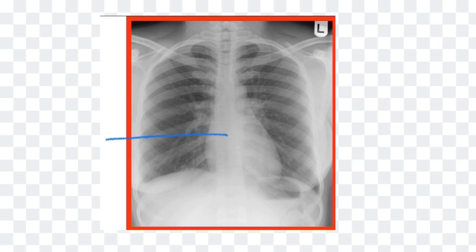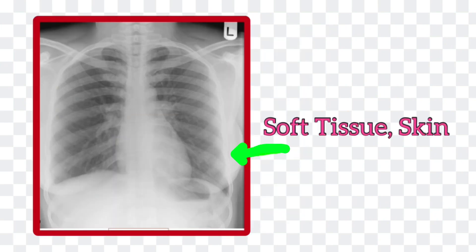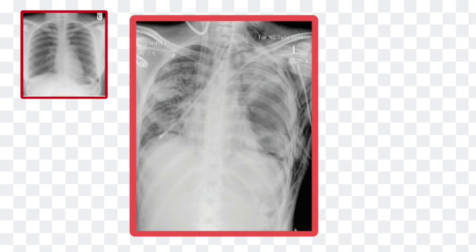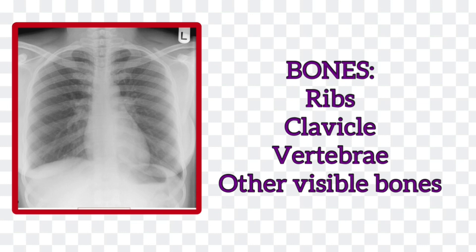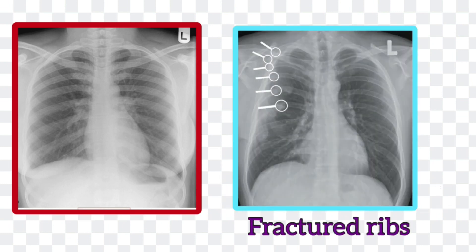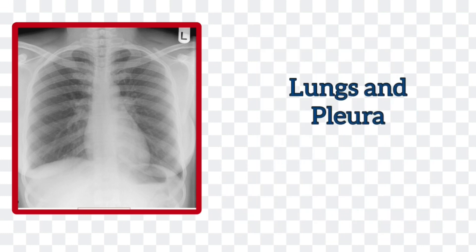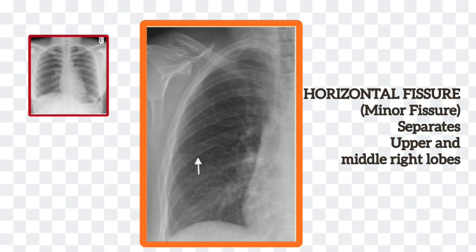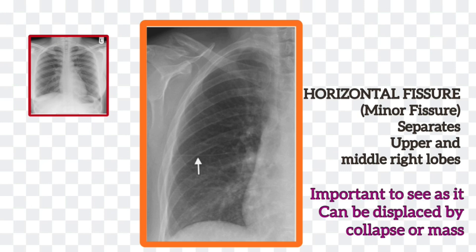Let us start reviewing this chest x-ray from outside to inside. First you come across soft tissues and skin — here you can see subcutaneous or surgical emphysema. Next, look at the bones: count the ribs on both sides, look at the scapula, clavicle, and humerus if visible. Since we are looking at bones, we can also check the vertebral bodies here. Next, look at the pleura and lungs. Both lungs should be of equal transradiancy. Try to identify the horizontal fissure on the right side — it runs from the hilum to the sixth rib in the axillary line. Look at the costophrenic angles, which should be well-defined acute angles.